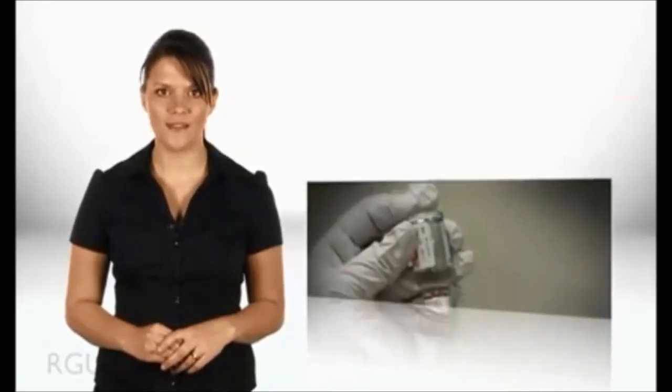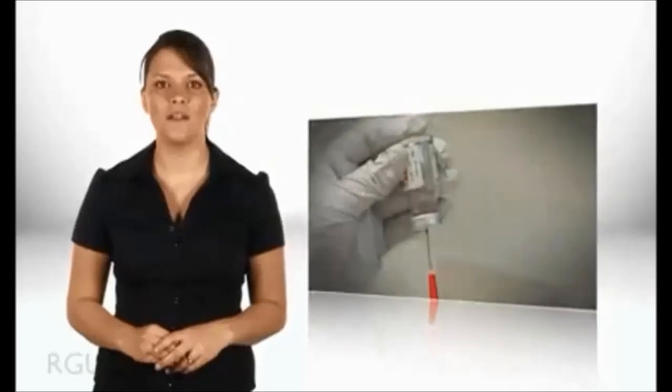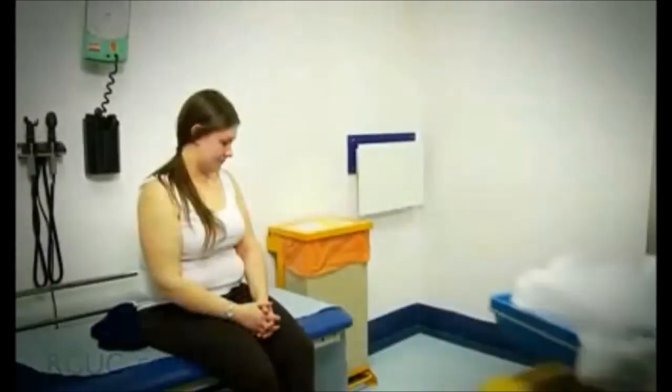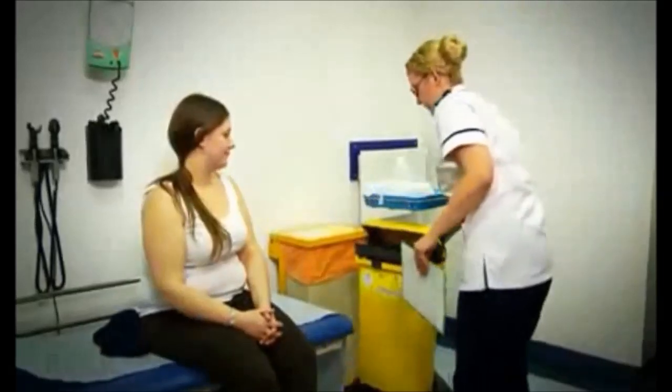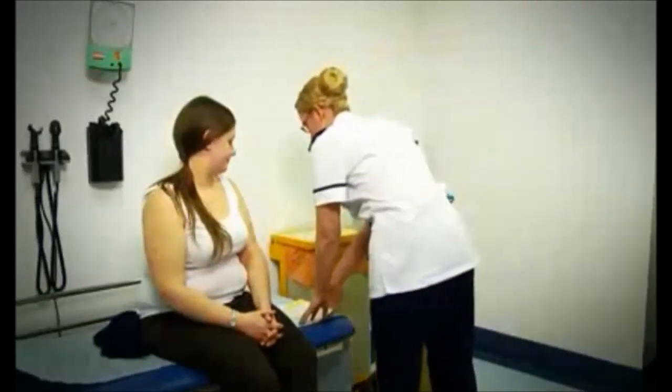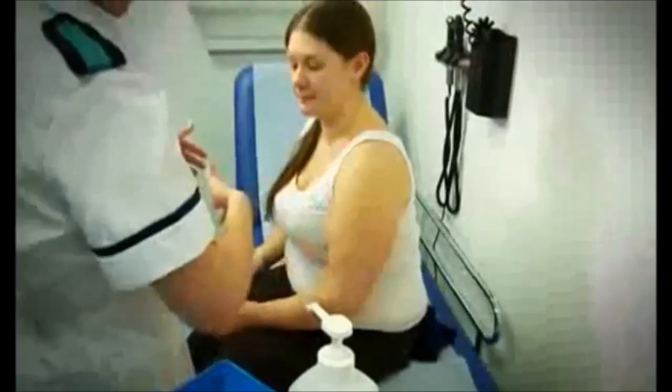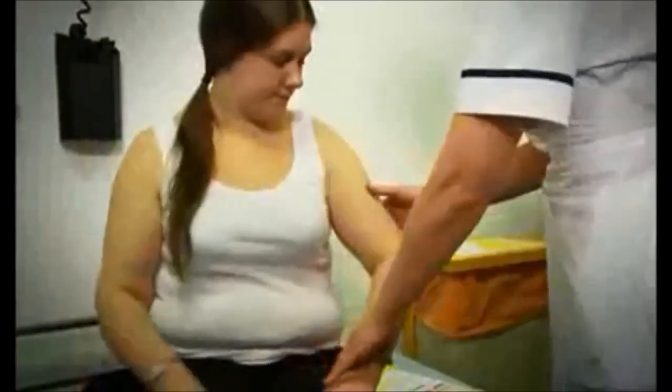You're now ready to prepare the items you'll be using. Check the prescription and prepare the medication if required, as shown in the Making Up Drugs for Parenteral Administration film. Ensure that the appropriate checks have taken place. Attach the needle to the syringe containing the medication if required. Gather the equipment and prepared medication or pre-filled syringe in a clean tray and take this over to the patient. Clean your hands and put on a clean apron. Position the patient and put on a pair of non-sterile gloves.